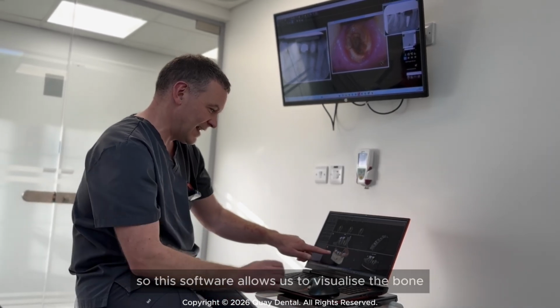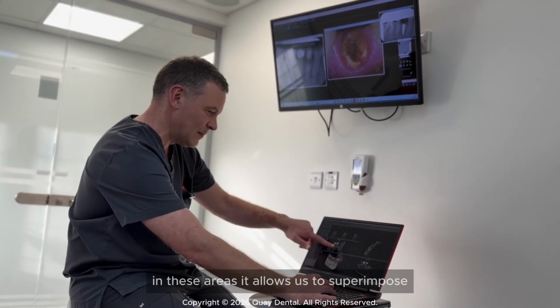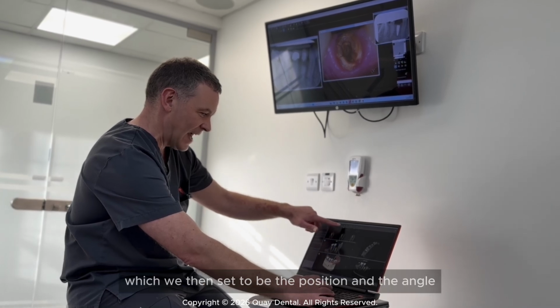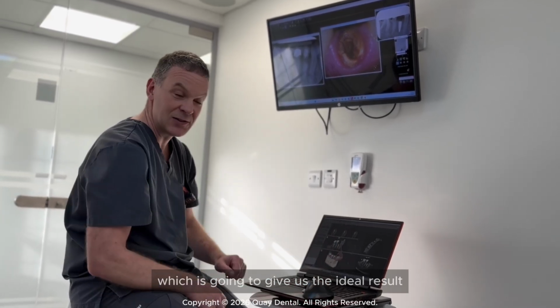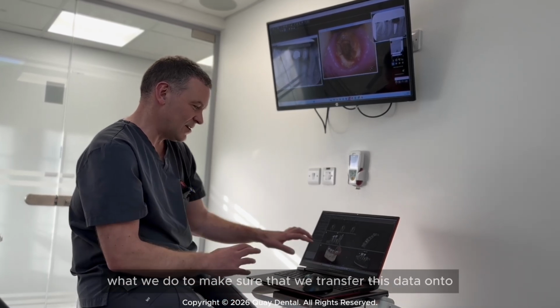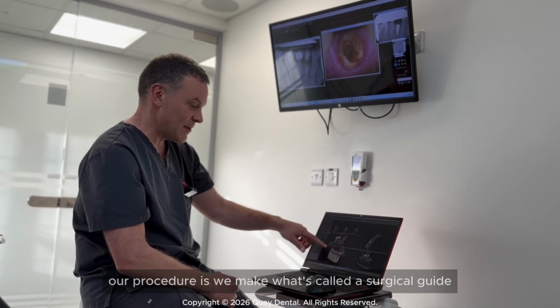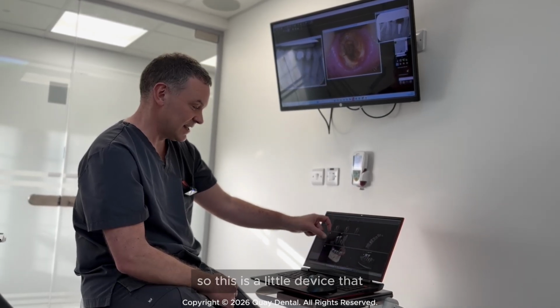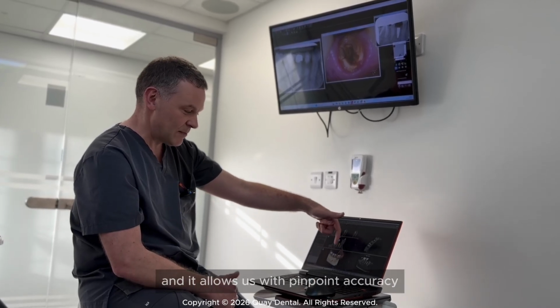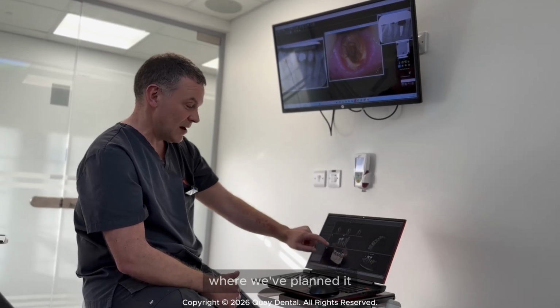So this software allows us to visualize the bone in these areas. It allows us to superimpose a virtual implant in there, which we then set to be the position and the angle, which is going to give us the ideal result with the end in mind. Now, when it comes to doing the surgery, what we do to make sure that we transfer this data onto our procedure is we make what's called a surgical guide. So this is a little device that at the time of placement we place over those teeth, and it allows us with pinpoint accuracy to place that implant in the ideal place where we've planned it.